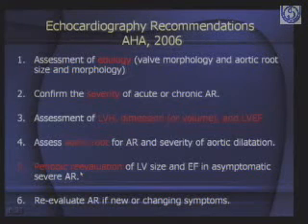Periodically, if the patient is asymptomatic, if the LV end diastolic dimension is not too high, then you can re-evaluate the patient for LV size and ejection fraction in asymptomatic severe aortic regurgitation. And that's one of the questions the students had asked on aortic stenosis, but it equally applies to aortic regurgitation. That is one of the strengths of echocardiography, periodic re-evaluation. And of course, you will re-evaluate aortic regurgitation if new or changing symptoms are there.